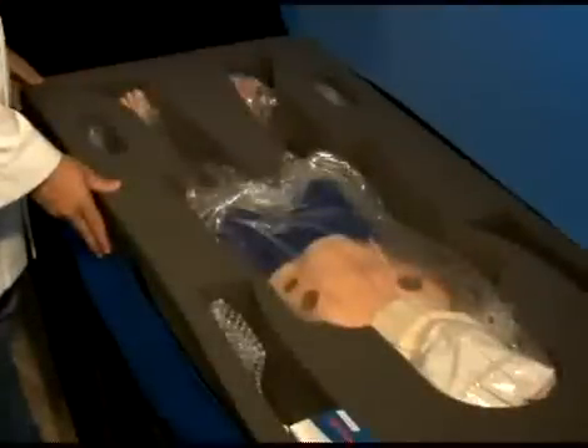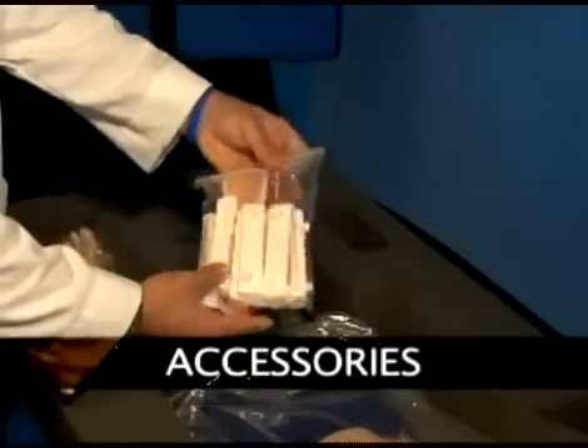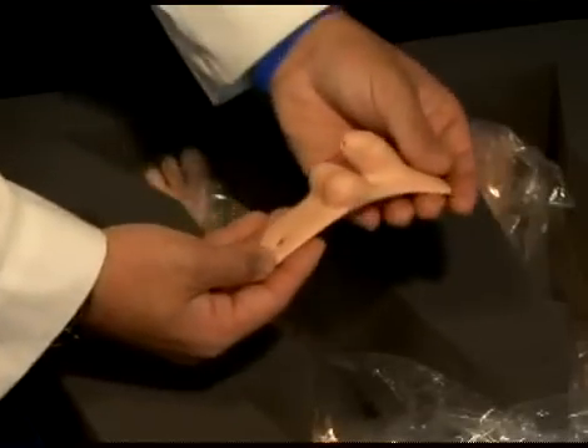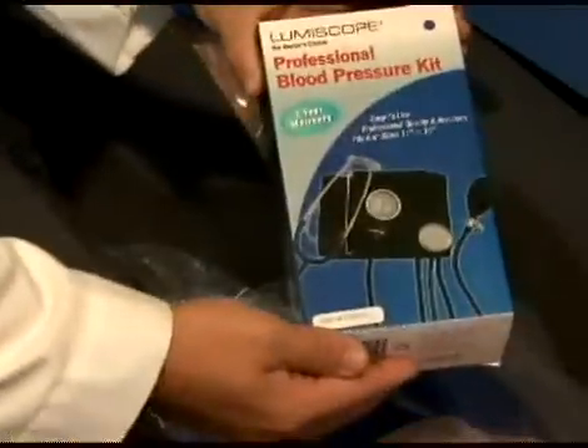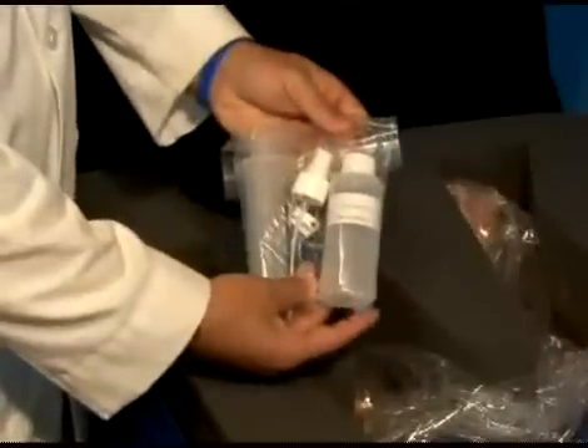Located in the pediatric mannequin case, you will find several accessories, such as replaceable leg bones, a tibia bone, skin, a set of interchangeable genitalia, a blood pressure cuff, silicone oil, and a battery charger.